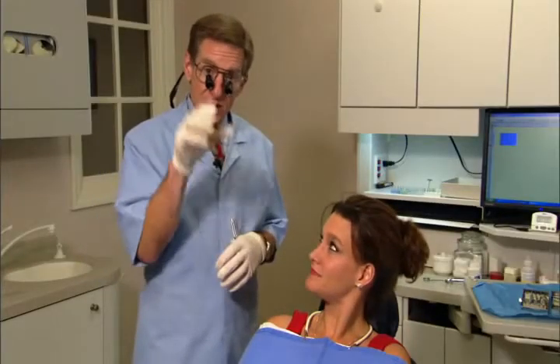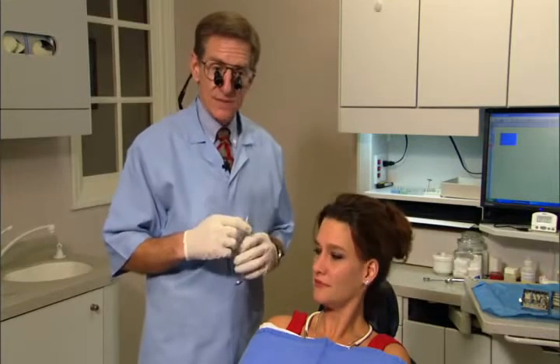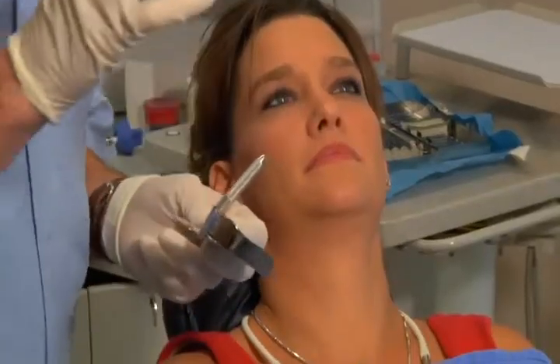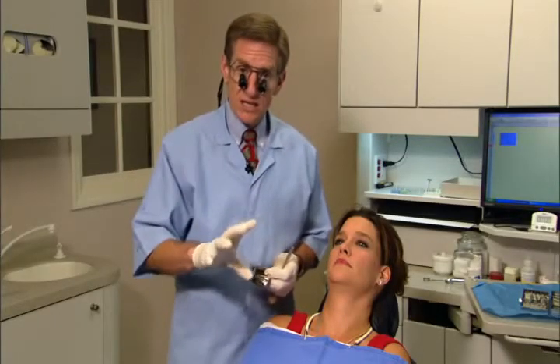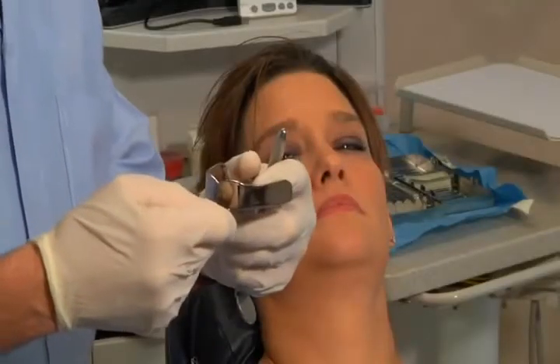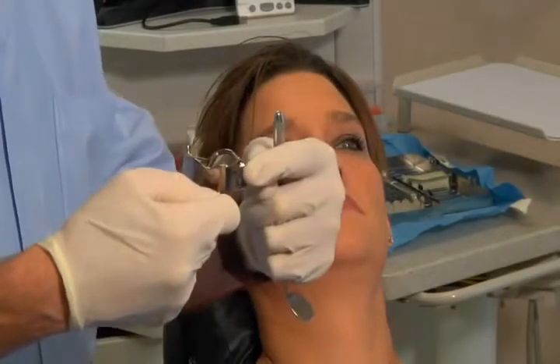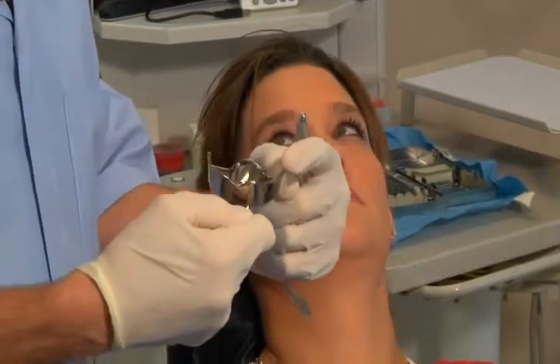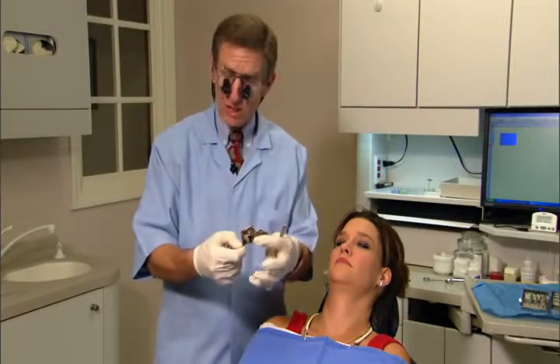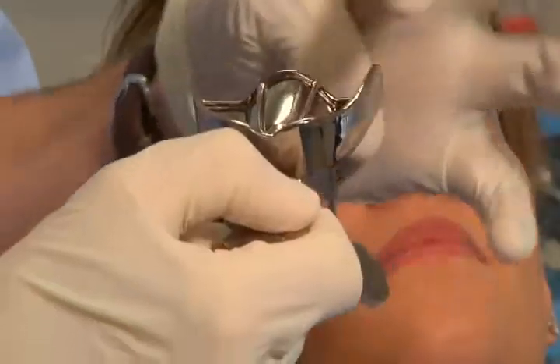Denise has a pretty small mouth with narrow arches, so we'll go to a smaller tray. This is a rimlock tray, and I encourage you to use one. Most people use a perforated tray, but I prefer the rimlock for a couple of reasons. With a rimlock, excess alginate goes out into the fornix of the vestibule, extending the cheeks and lips, giving you a much better impression of that area.